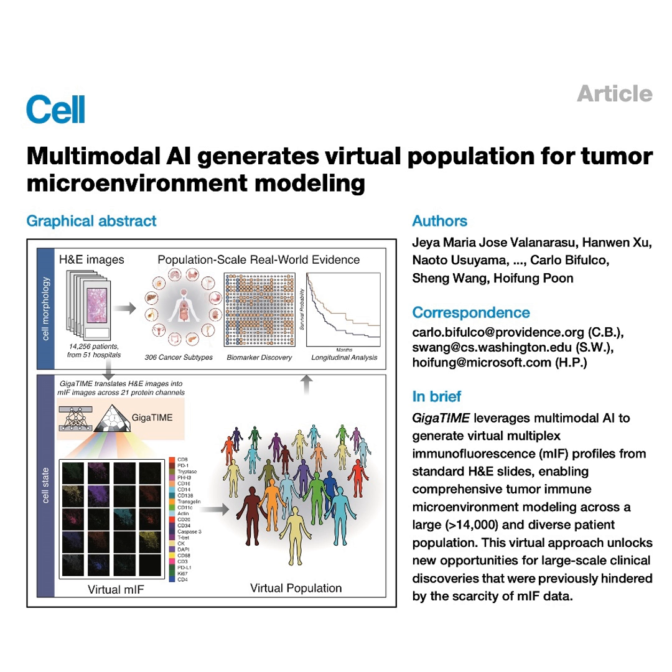Last big question. How well does this generalize? The model was trained on one set of data. How did it do on a totally independent data set? A crucial test. They applied it to over 10,000 tumors from the Cancer Genome Atlas, or TCGA. And the concordance was excellent, a Spearman correlation of 0.88 between the two populations. The model works. But, and this is a really important point, the Providence real-world data actually yielded 33% more significant pan-cancer associations than the highly curated TCGA data. So the messy, diverse real-world data was actually richer. It was richer. It's a huge endorsement for using these large-scale clinical data sets.